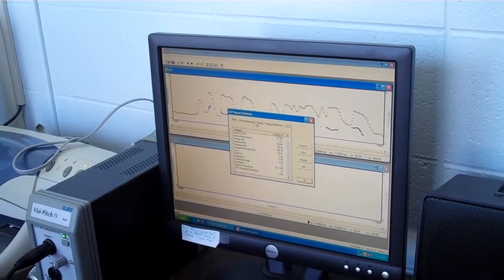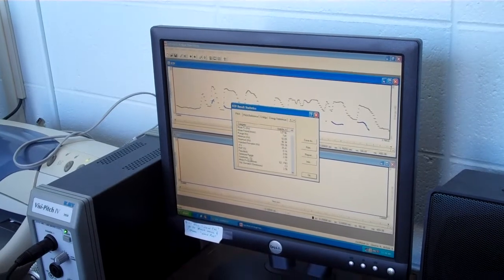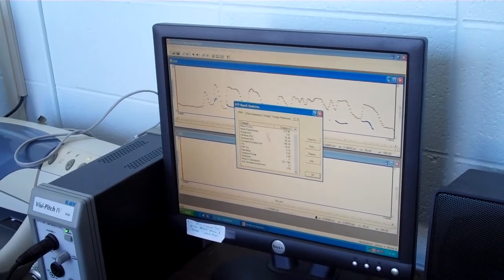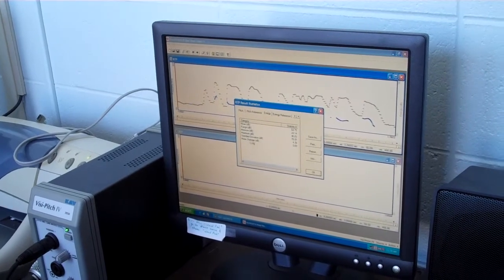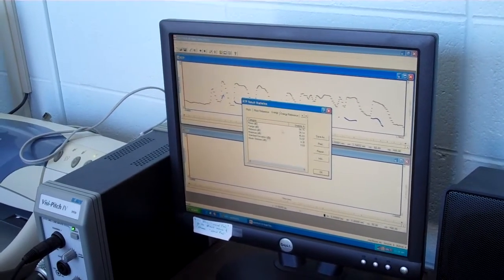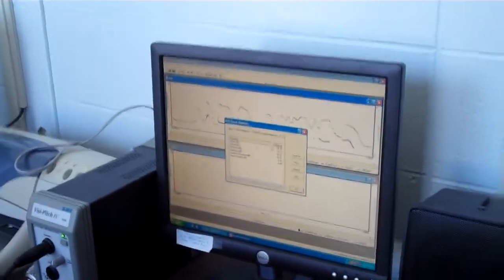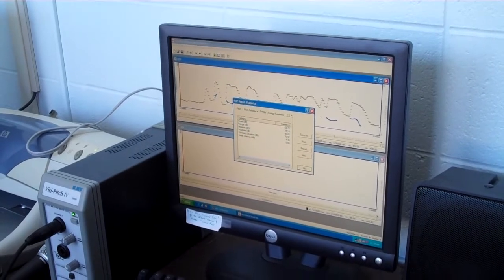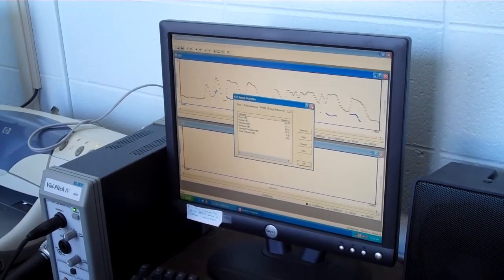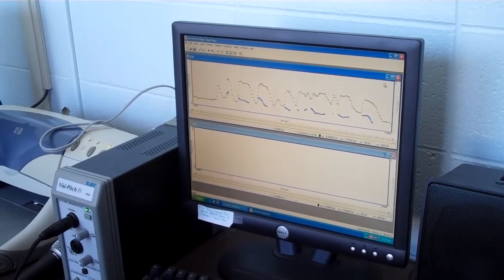Again, we want pitch. Take your fundamental frequency, your jitter or RAP percent, click over on the energy tab, and you can then find your shimmer measurements. This also gives you your mean decibel reading as well, but you don't need to record that. So we'll close that window, and you're finished with the first part of the lab.